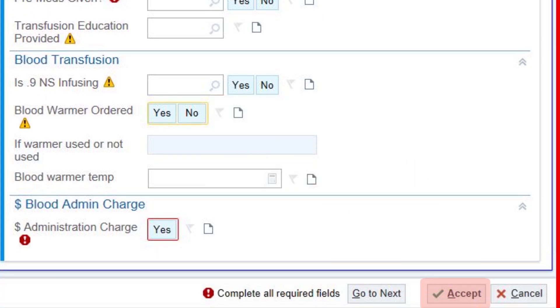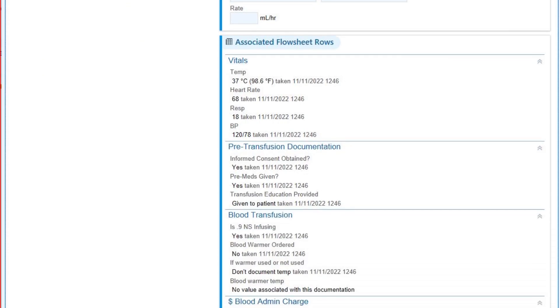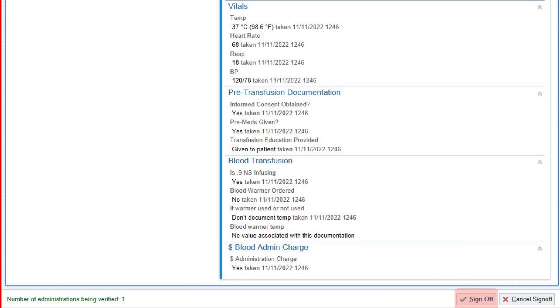After you choose Accept, it will give you a chance to review your documentation before choosing Sign Off at the bottom. Then it will prompt you to have your partner sign in, verifying that they completed the double verification process with you and that you found no discrepancies. After they have signed off, they are free to leave, and you will complete the blood administration process for this patient.